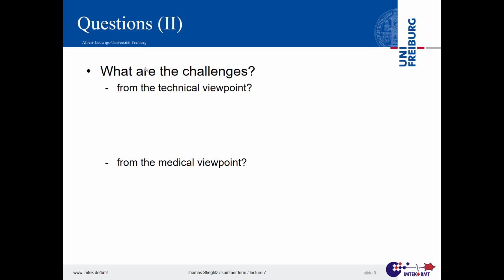Either we have some actuation principles that need magnetic fields, then we would need strong magnets outside, and we have to take care that they are not too strong, so that we don't penetrate our intestines, and those mechanisms are sometimes hard to control. I've seen recently this year some really cool clips where people made some new materials that looked like a paper clip, and they were able to walk some centimeters, and they were able to carry a little load and then release that load. But that was very fundamental science, so it was nice to watch, but far from being applicable. And that is really one of the challenges there: how to get functionality without losing reliability and robustness.